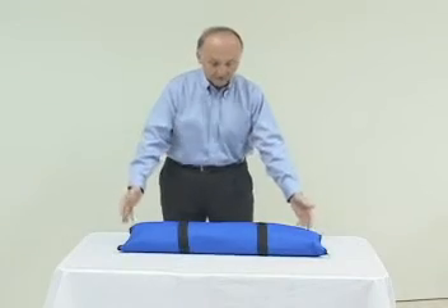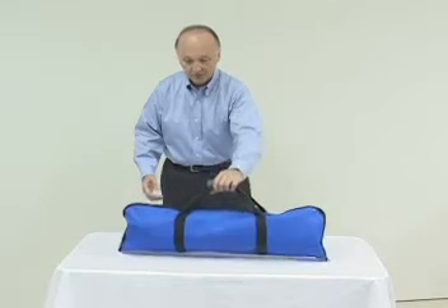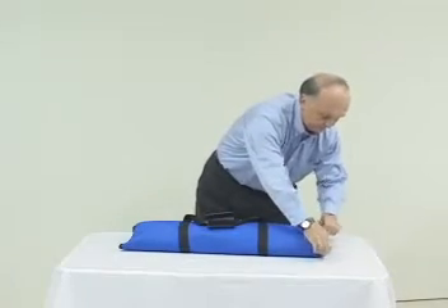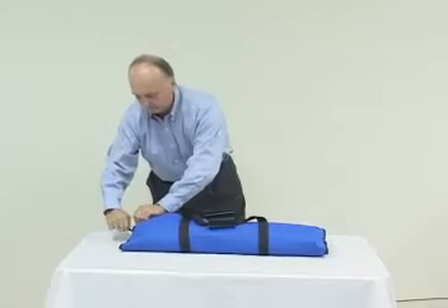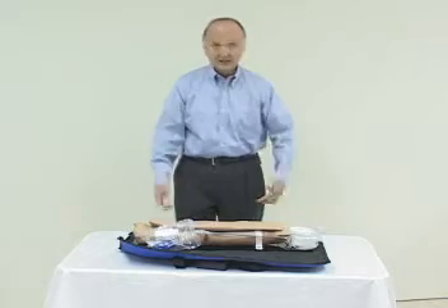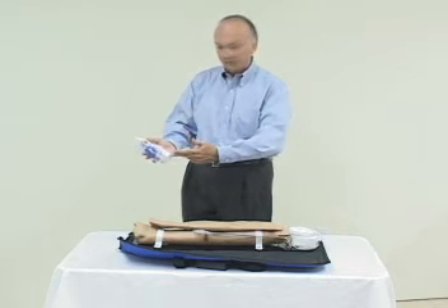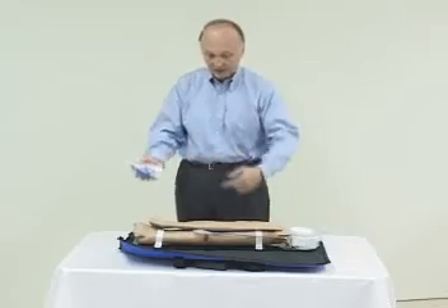When you receive the arm at your location, it comes in this convenient carry case — very portable. We're going to open it up and unzip. And this is what you're going to see after you open it. We have a small accessory case here containing some talcum powder, containing a squeeze bulb, and a small wrench.